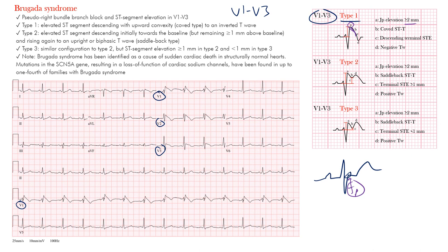In Type 1, the J point is elevated — in this case it should be greater than 2 millimeters. We have that coved-type ST segment morphology, and then a descending terminal ST segment elevation. That means it's coming down past the baseline into an inverted — negative — T wave. The red marker shows 2 millimeters from top to bottom. Type 1 is the most unique; Types 2 and 3 tend to be similar in morphology.